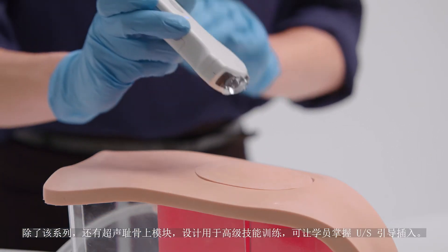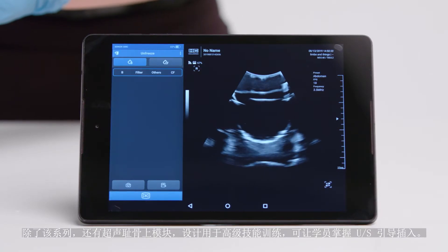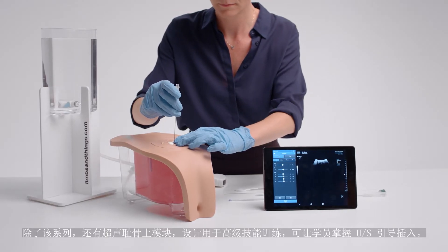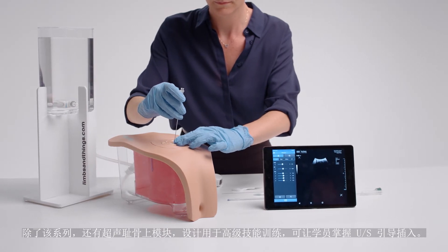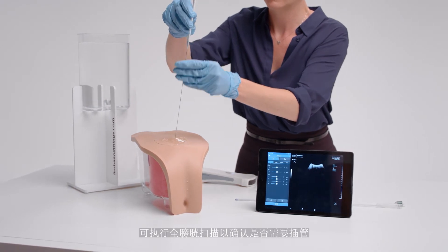In addition to the range is the ultrasound suprapubic module, designed for advanced skills training, allowing trainees to master ultrasound-guided insertion. A full bladder scan can be done to confirm the need for catheterization.